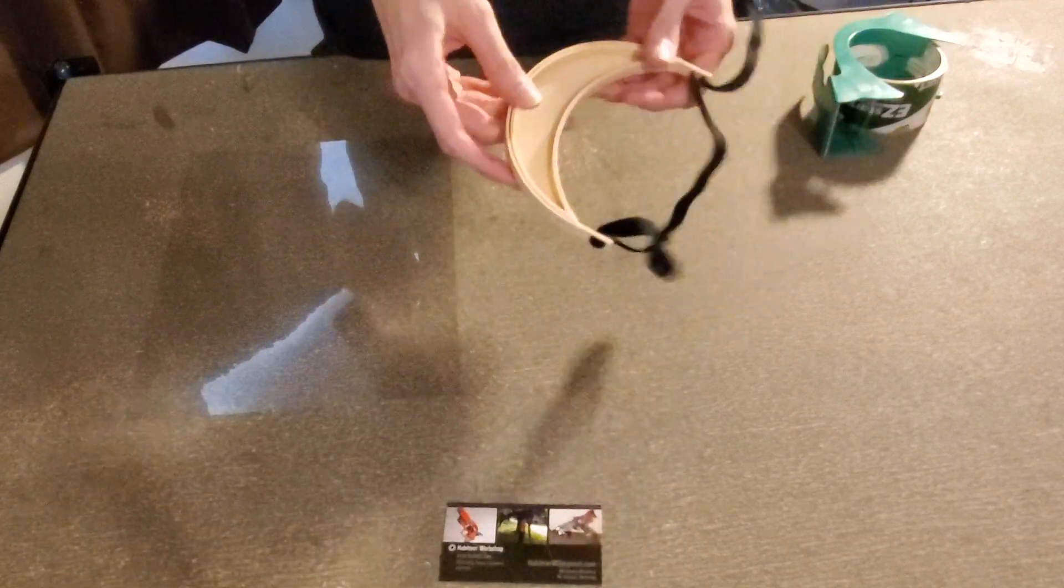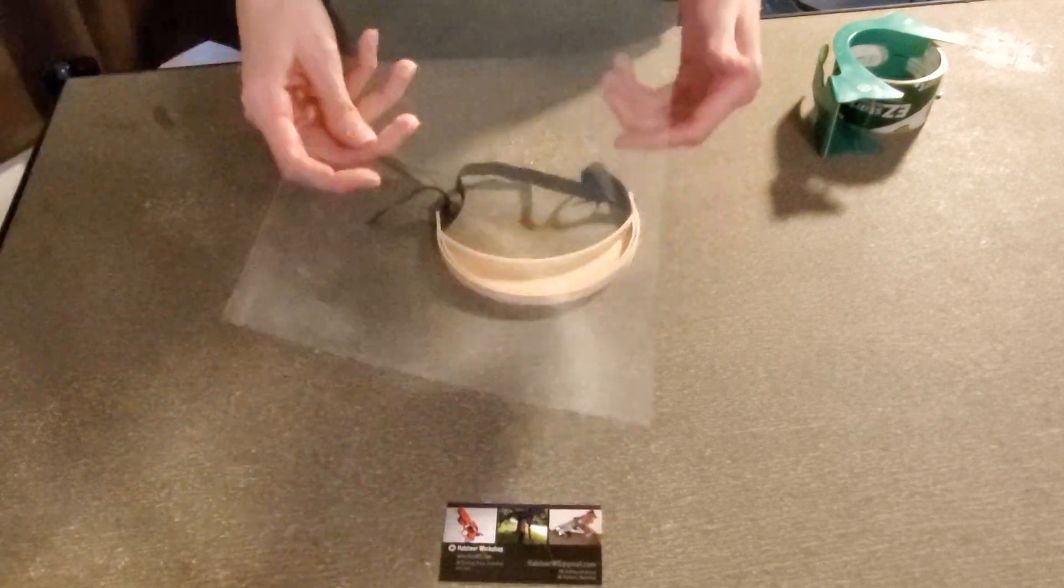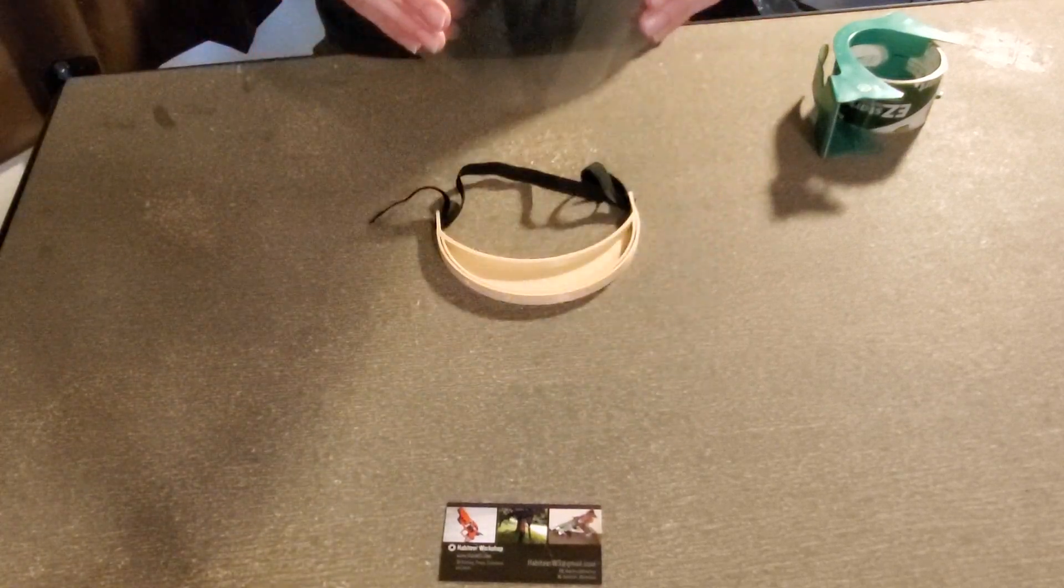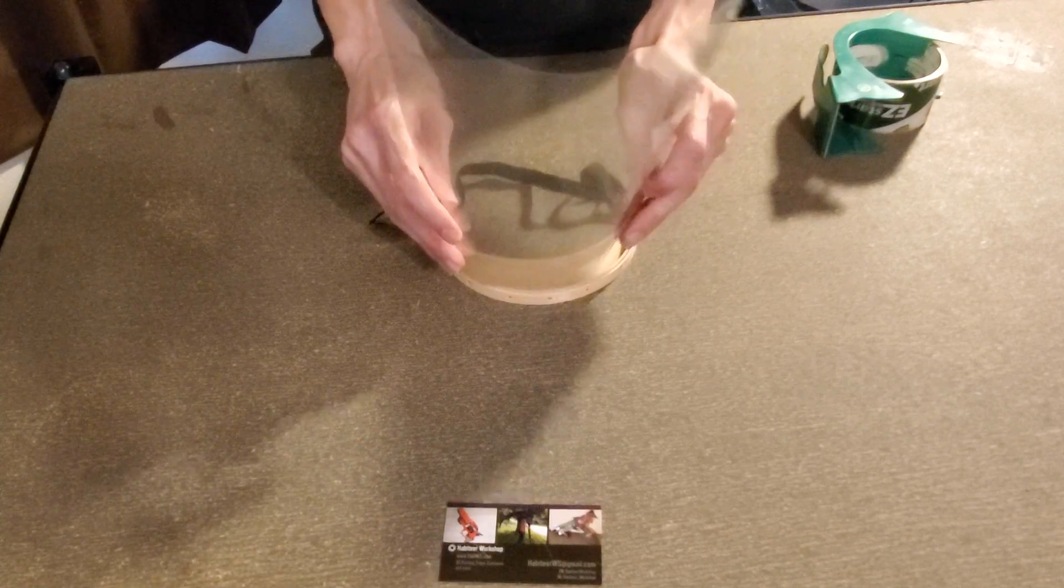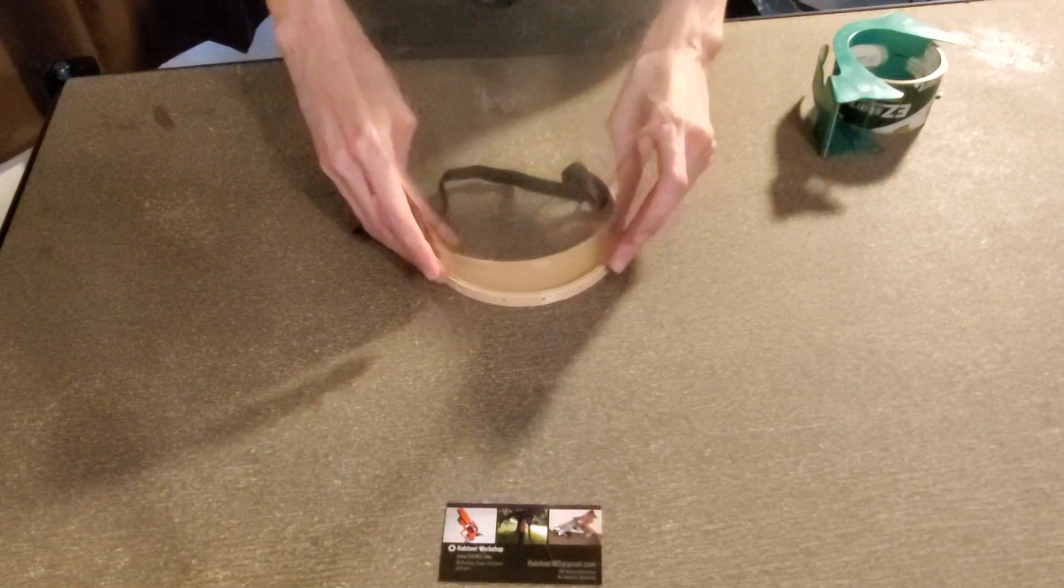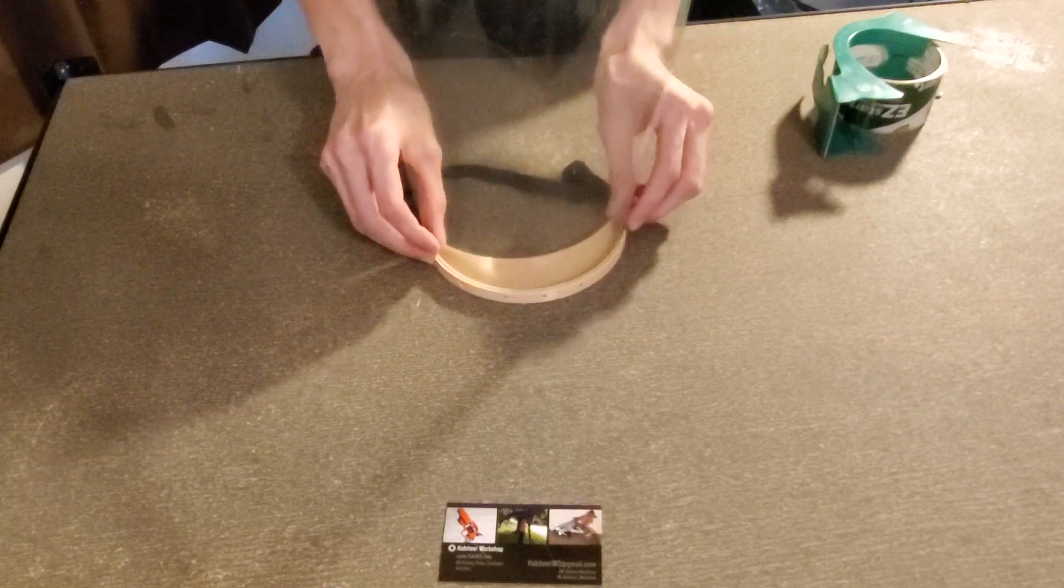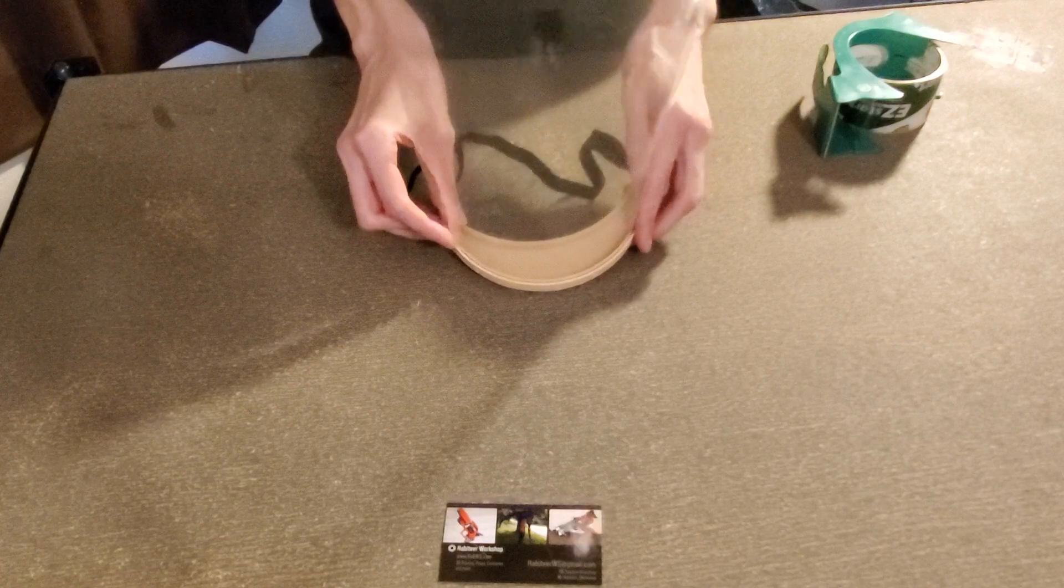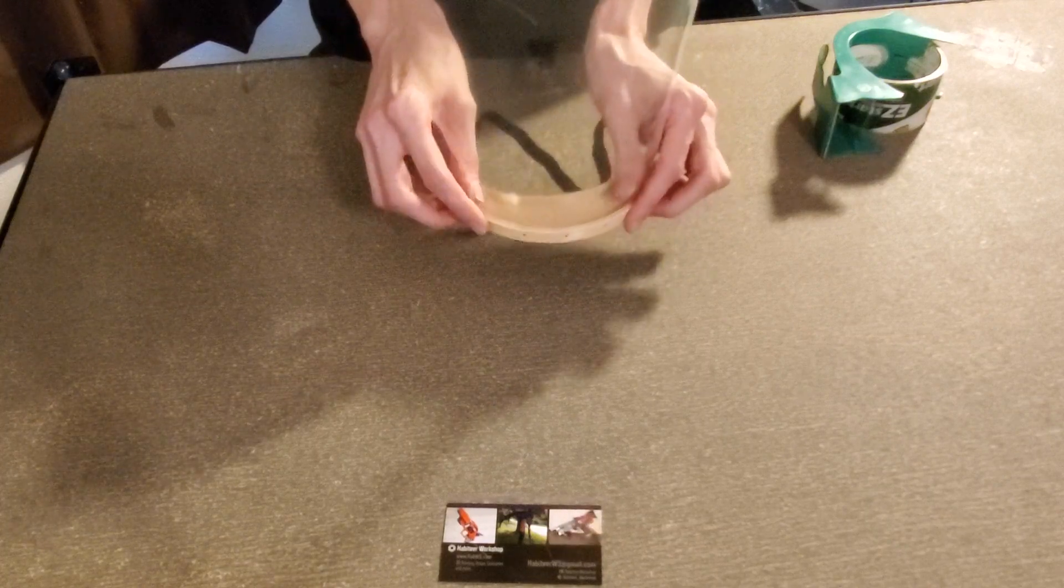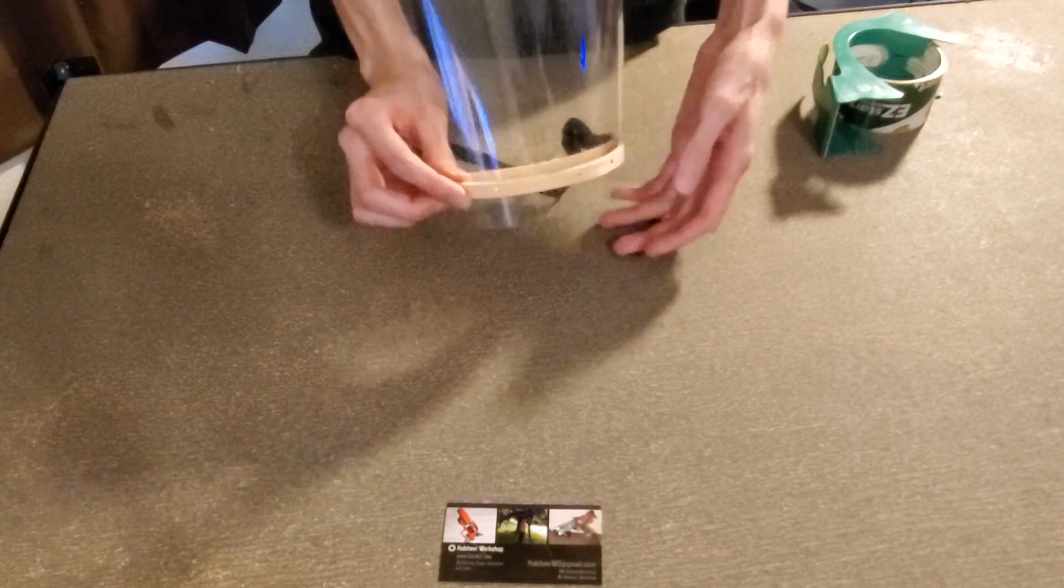Next thing you want to do is grab your A4 transparency paper and bend it slightly, and then just slot it in. So start at the middle and then make sure the sides are all aligned and that goes right on through.